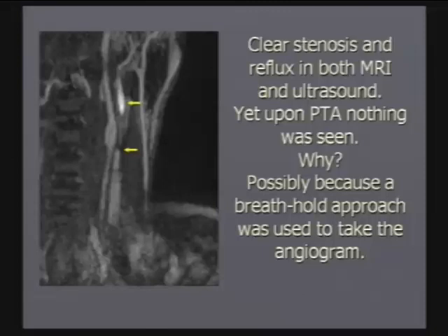The ultrasound showed there was reflux here. And I think the young lady who was involved in that is actually here in the audience. And then we had done an MR here, and we found what looked like a narrowing. There may be a thin connection with the upper region.